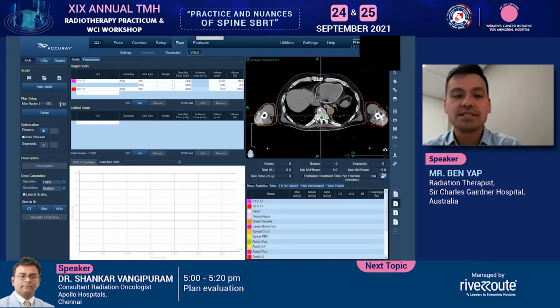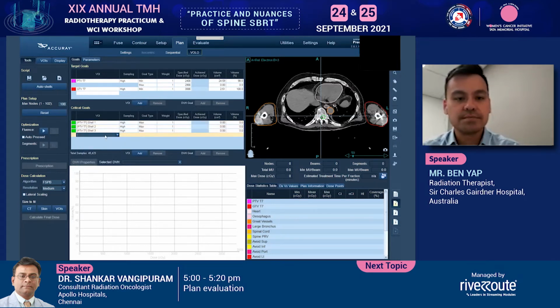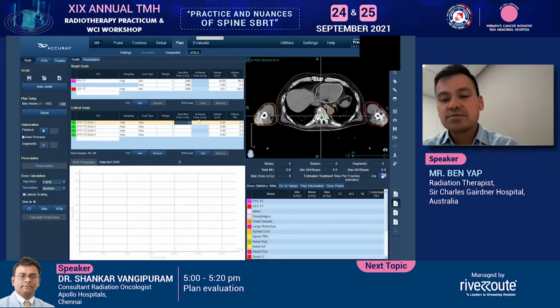It really depends. I'm going to pop this up 100. I'm going to put each shell in. All right. And what I'd usually do, for this particular case, is the first shell is going to be a prescribed dose. Your second is going to be 50% approximately. Your third's going to be, I reckon, 1/3. The next one is just something under 1/3.